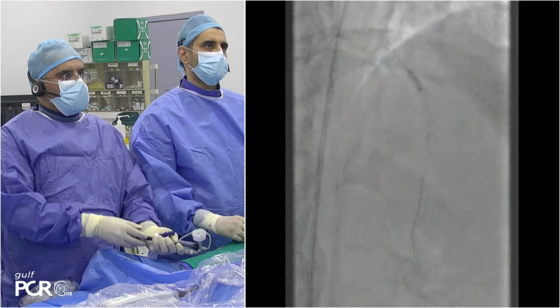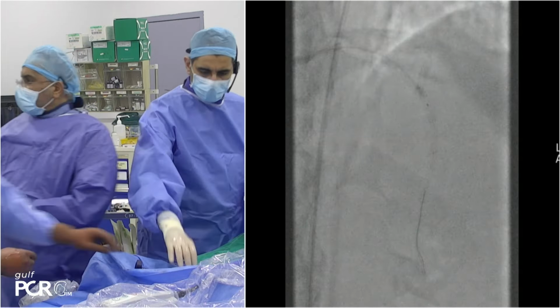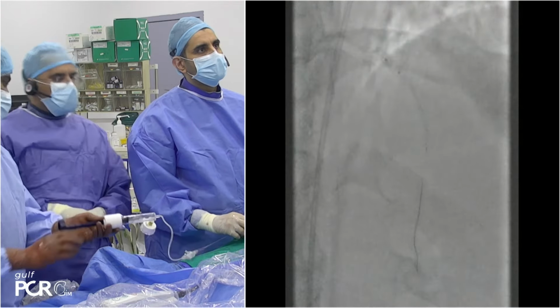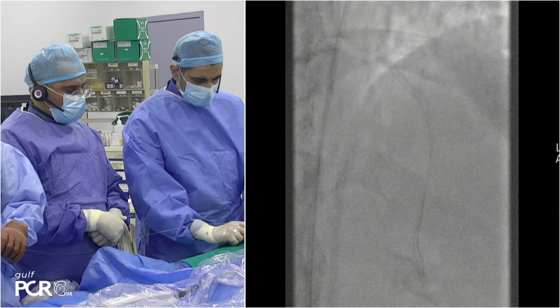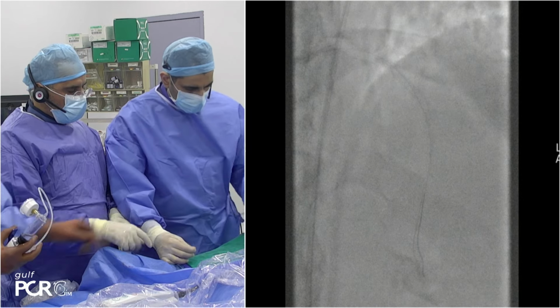Here, the first priority is expansion of the distal, plus see if the thrombus is gone or not. If it's not gone, we need the small molecules. And then, because they wanted to finish with a perfect procedure, just one proximal post-dilatation to fix the malposition. Not for thrombus, but for getting an optimal result. Thanks.